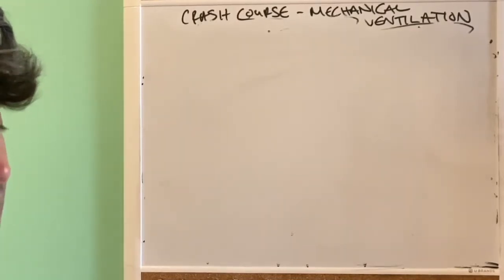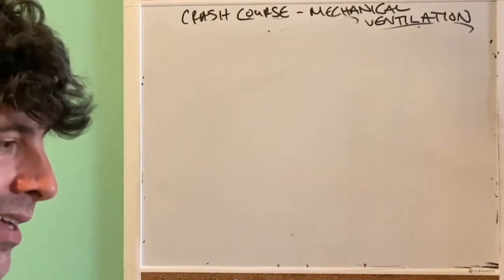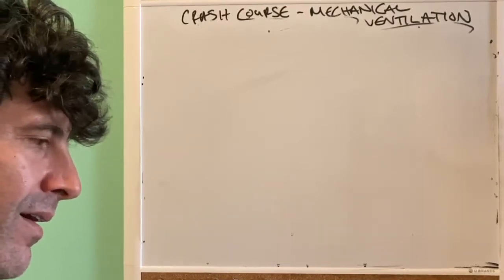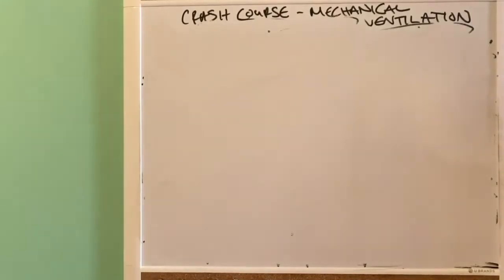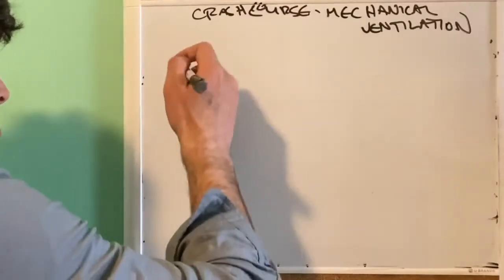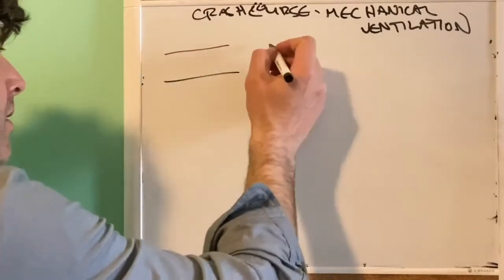And so you've decided that, at least at this point, we are done sacrificing the patient's sleep-wake cycle and diaphragmatic weakness and everything like that. We finished sacrificing that because we hope that they got through the major portion of the disease, or whatever happened that made us sacrifice that is now clearing up, all right? So we know what the normal scalars look like, all right? And I'm going to draw the normal scalars here.